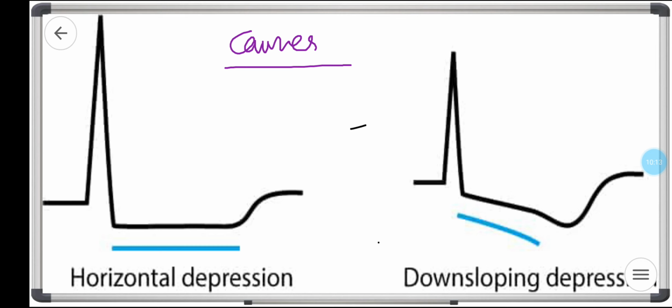So that's all about ST elevation and ST depression. We will be discussing pericarditis and the other things like procainamide and digoxin effects, and we have talked a little about other things as well, the ventricular aneurysms and Prinzmetal angina, benign early repolarization, in separate videos.